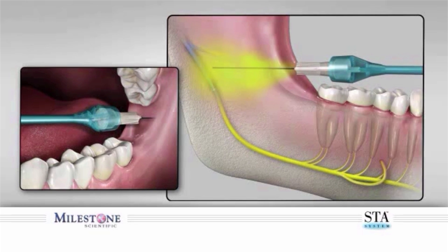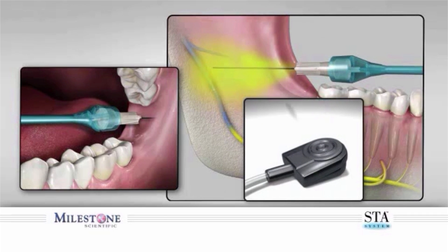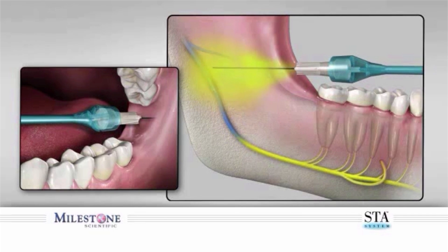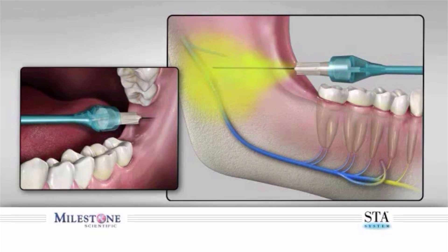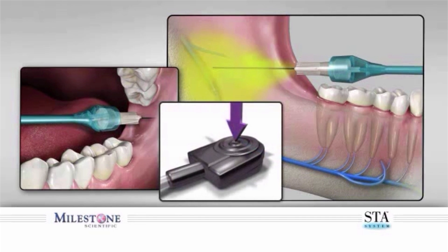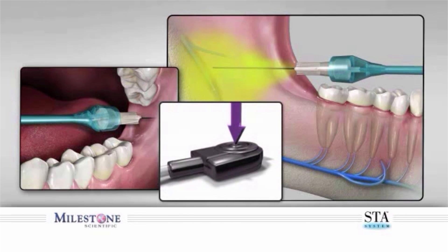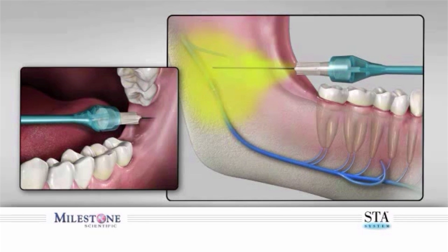Once you are at your target site, perform an aspiration by depressing and releasing the foot control. If the aspiration is negative, continue the injection. If aspiration is positive, reposition the needle and repeat aspiration by depressing and releasing the foot control pedal again until a negative aspiration is obtained. Continue the injection by depressing the foot control pedal. It is recommended that the first quarter of the cartridge be dispensed using the controlled flow rate before transitioning to the rapid flow rate, which is used only after your patient has acknowledged soft tissue anesthesia of the area being injected.